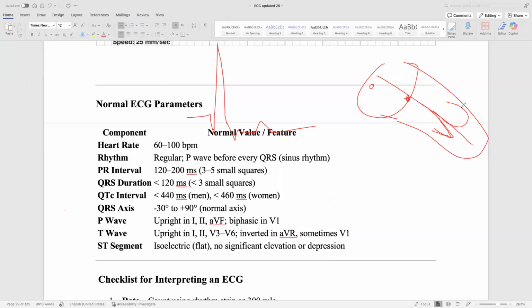You will know now, when there is bundle branch block, how it will appear in the ECG. There is the right bundle, the left bundle, and the Purkinje fibers here. With the normal bundle of His, normal right bundle and left bundle, the electricity will go here and there at the same time, producing one spike.